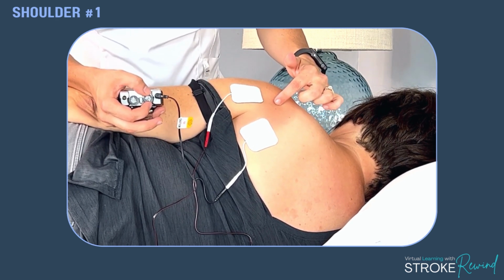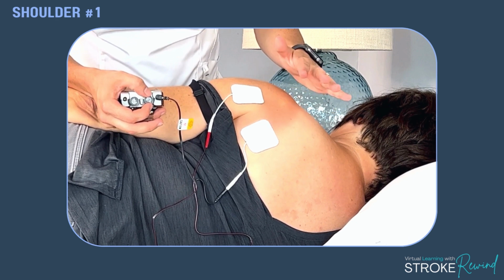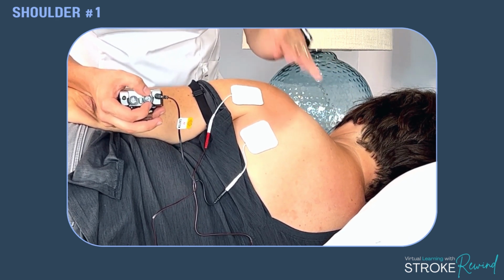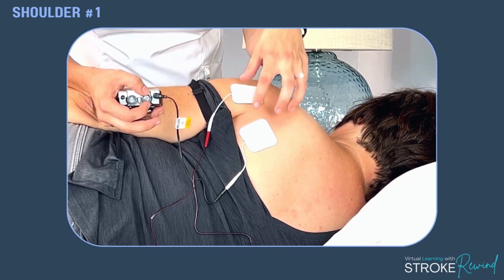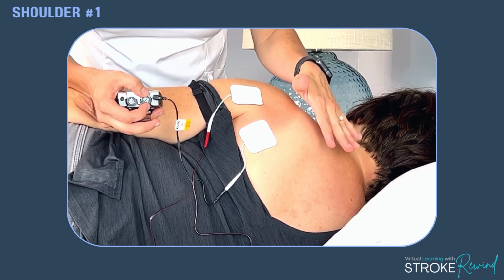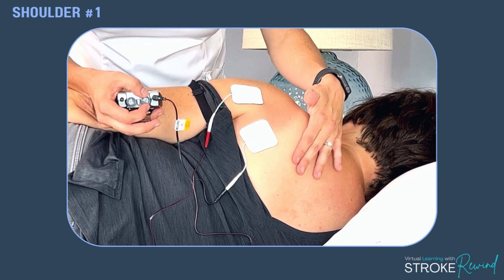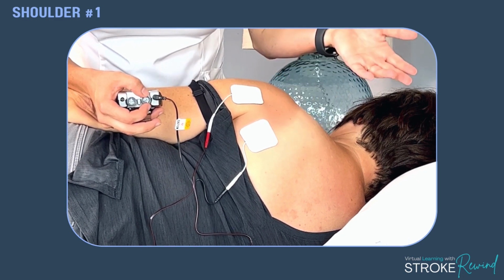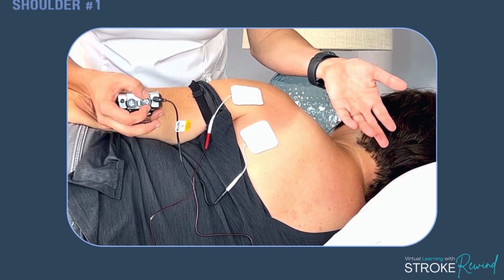I would leave this on 10-15 minutes. I am simply reminding the shoulder, hey brain, this is how this particular muscle is supposed to move. Again, it should not hurt. So if you put it on a bony area, it may be uncomfortable, and the person can just say, hey, that's uncomfortable. So that's the first placement, so let's move on to the second.